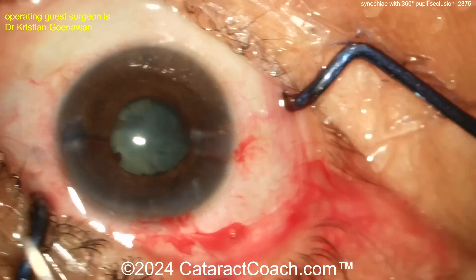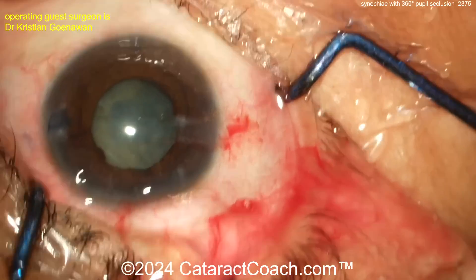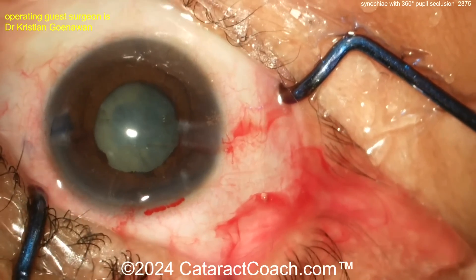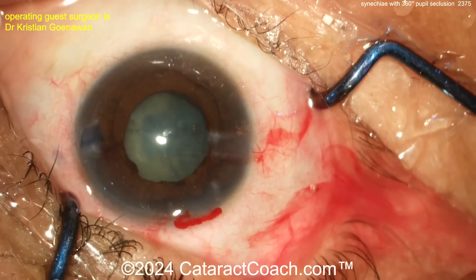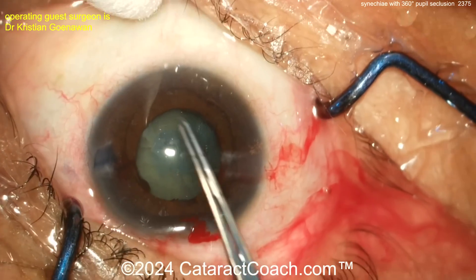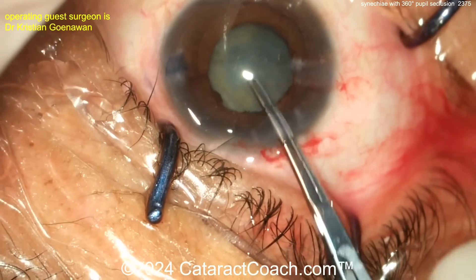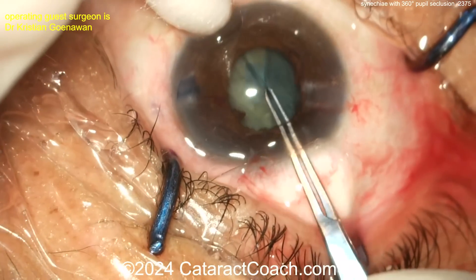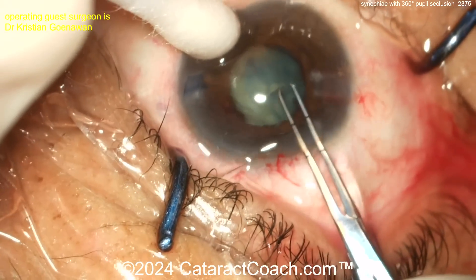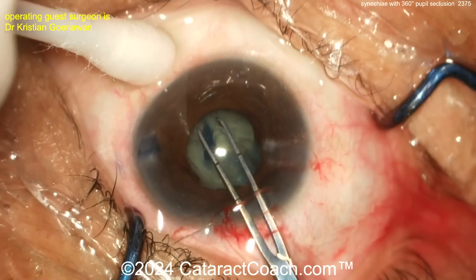Actually, the pupil has expanded quite a bit. With some viscoelastic and viscomydriasis you've probably got about a four-and-a-half millimeter pupil, which is plenty to get the case done. Now get the rhexis done — make sure you get a juicy rhexis, meaning at least five millimeters. The pupil is just about five millimeters too, so go right to the pupil margin.